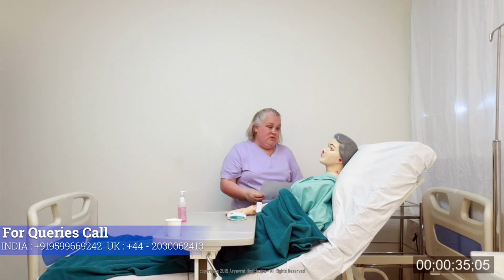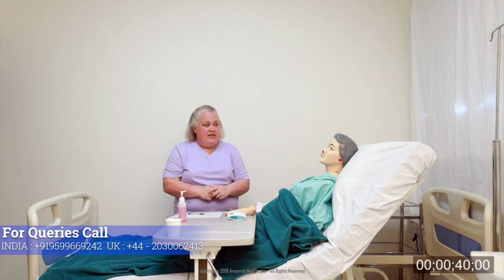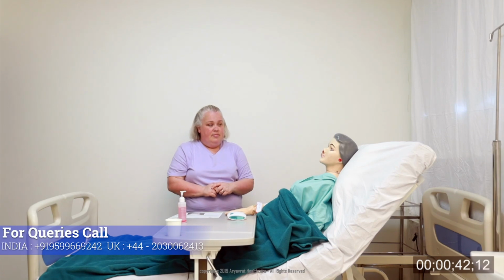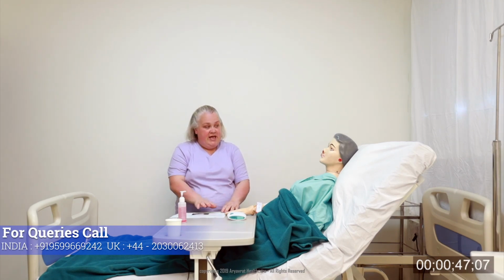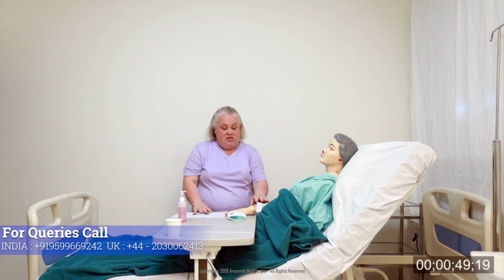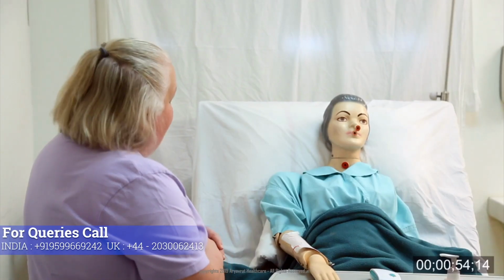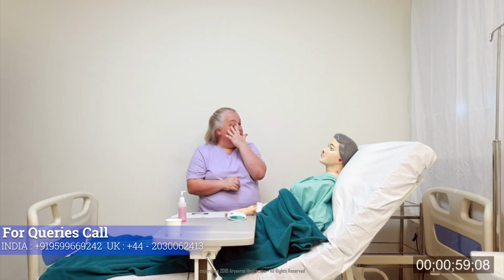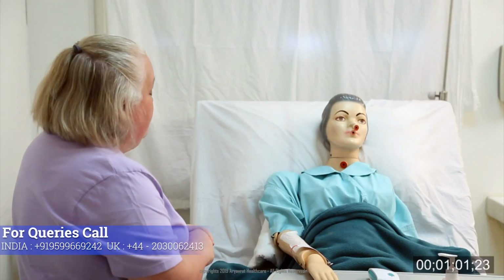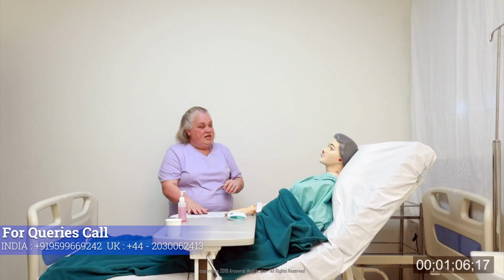Okay, I see you've got a red wristband here, Helen. Do you have any allergies at all? Yes, I'm allergic to penicillin. Okay, what happens when you take penicillin? I get a rash all over my body and my throat swells up. Okay, we'll make sure that you don't get any penicillin whilst you're here. It is documented on your notes, and you do have a red allergy band, so that should alert everybody. Do you have any other allergies at all, Helen? No. Do you suffer from hay fever or anything like that? Yes, I do suffer from hay fever. I see from your notes that you have asthma as well.